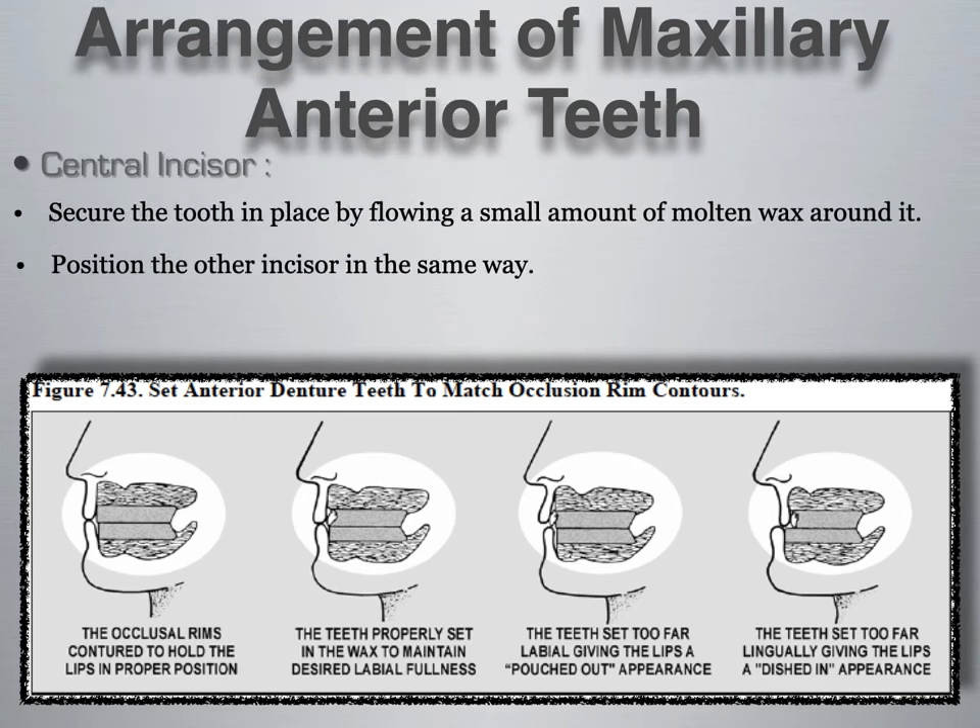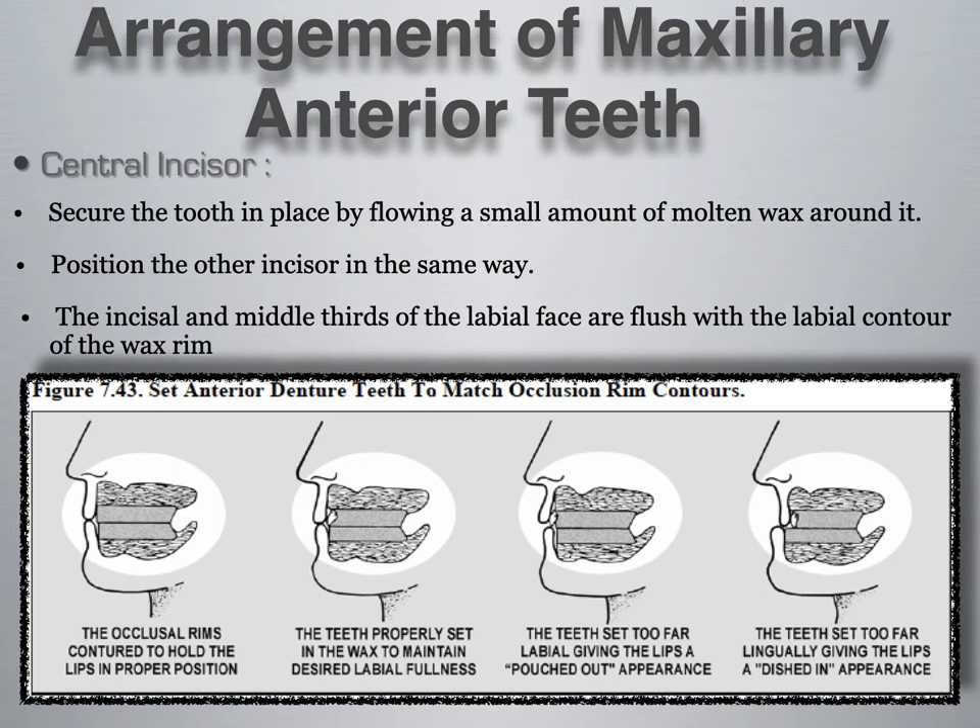Secure the tooth in place by flowing a small amount of molten wax around it, then position the other incisor the same way. The incisal and middle thirds of the labial surface are flush with the labial contour of the wax rim. It's important to follow the maxillary rim, as this is done by the clinician to achieve proper lip support. If the wax rim seems bulky facially, chances are that wax was added because the patient was deficient in lip support, so it is important to follow the maxillary rim.